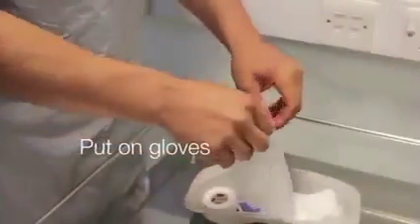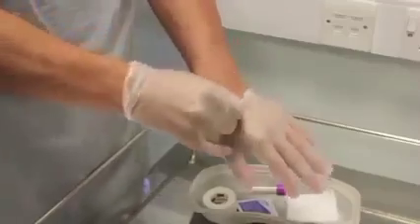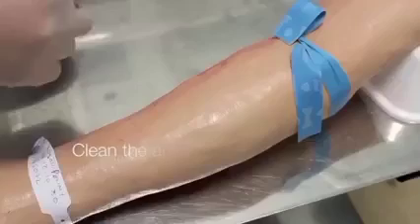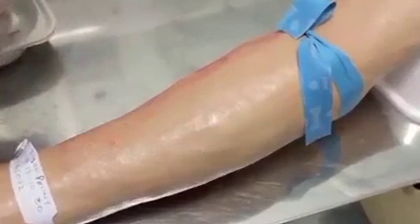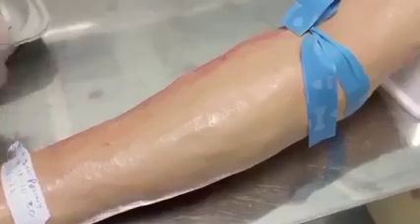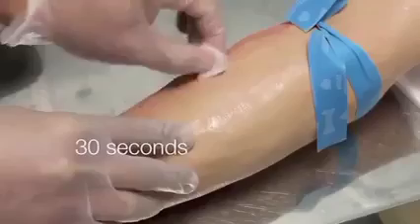Put some non-sterile gloves on. Use an alcohol swab to clean the area that you're going to take the blood from. Clean it in a circular motion for about 30 seconds.